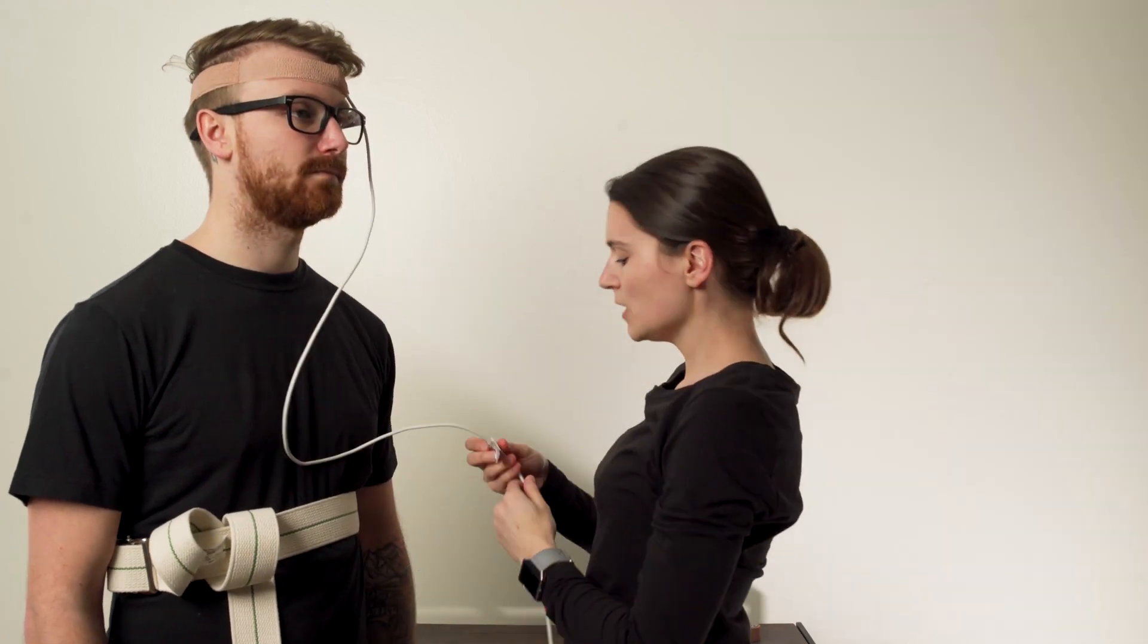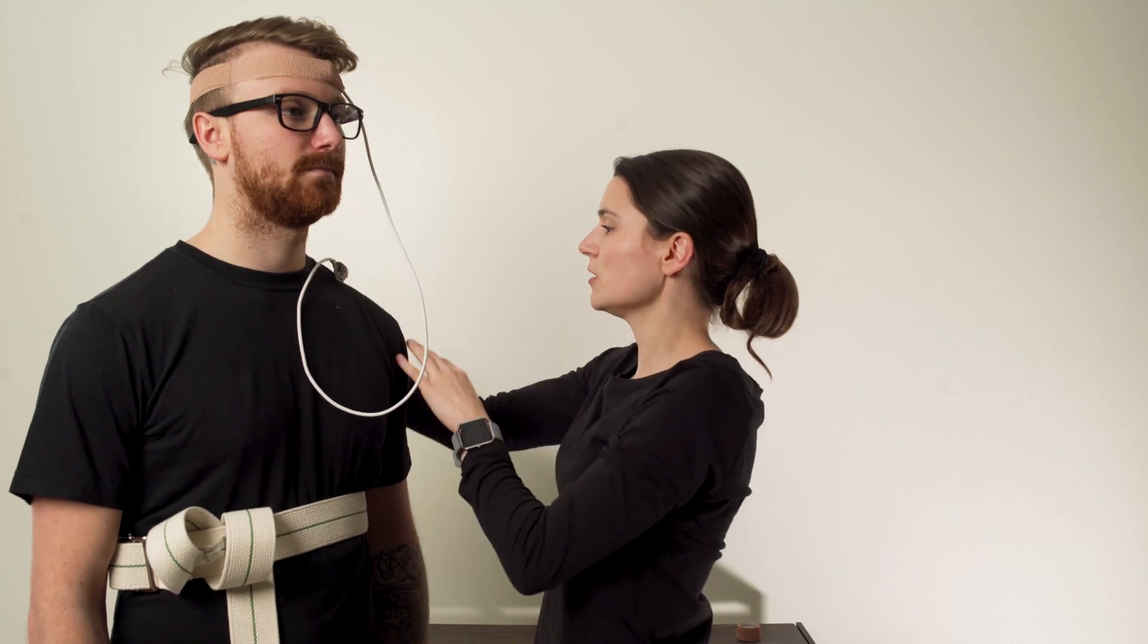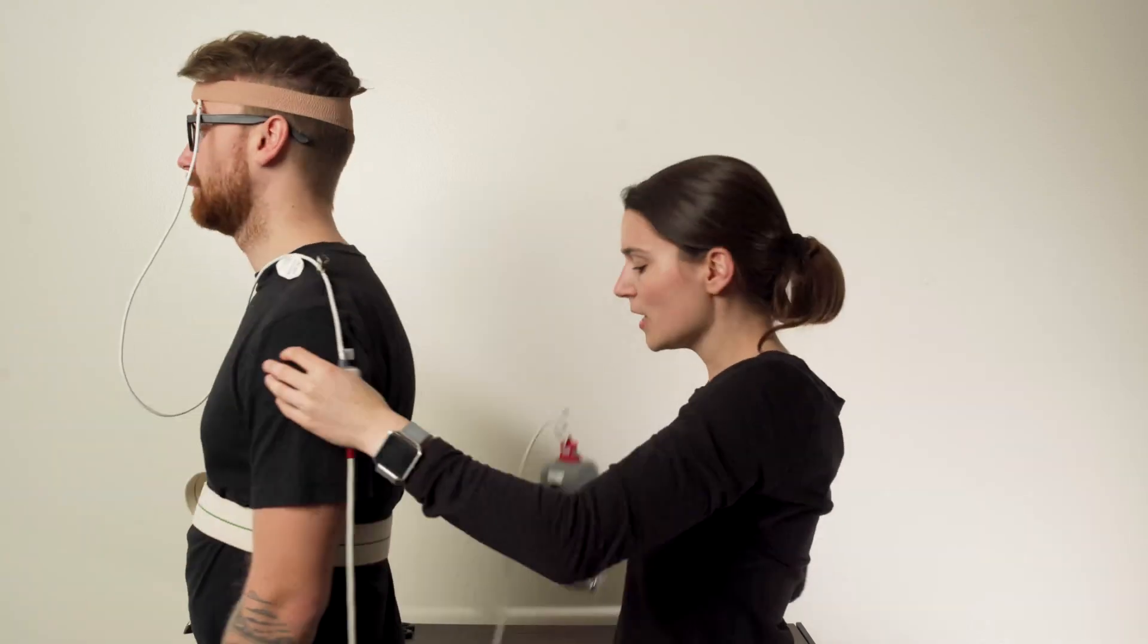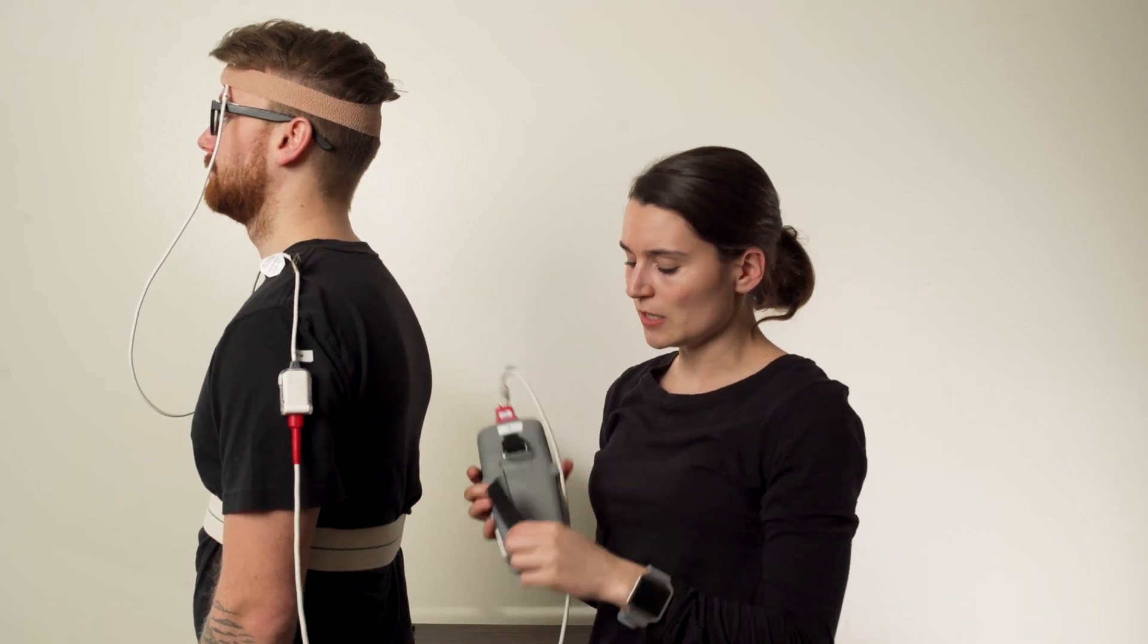I recommend using a clip to secure the cord directly to the patient's shirt. To attach the pulse oximeter to the patient, use the strap on the back to secure it to the gait belt.